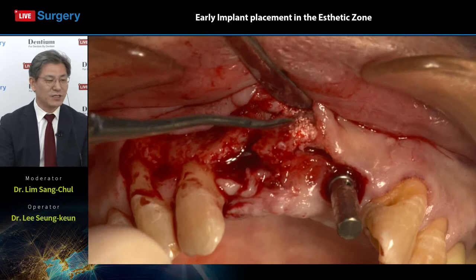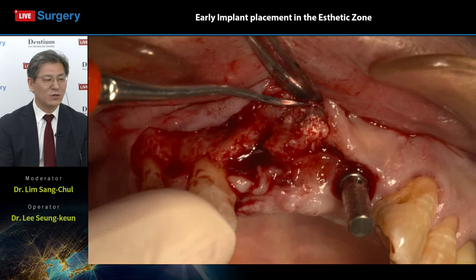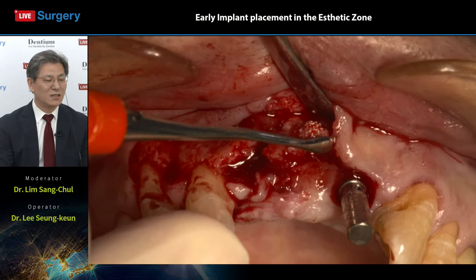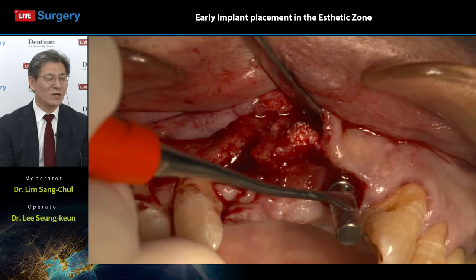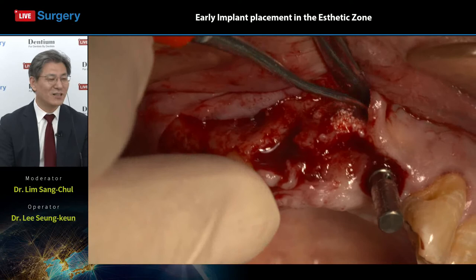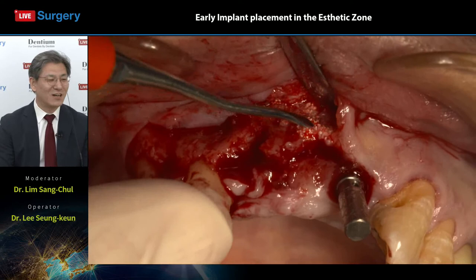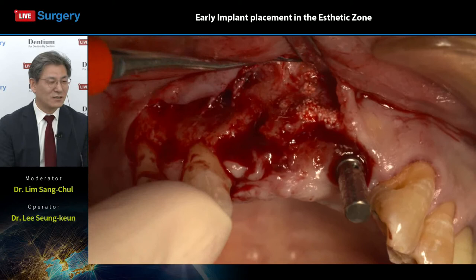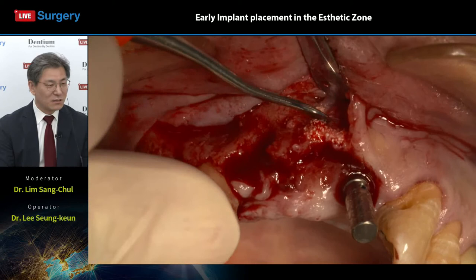It's maybe Osteon collagen. Uh-huh, Osteon collagen. About 10 years ago, I used Osteon collagen. Wow. So this is a 10-year-old Osteon collagen, still surviving there. Very interesting situation. I have never seen a 10-year-old Osteon collagen with a particulated situation. So very interesting. Now you see 10-year-old Osteon collagen, very strong and stable.